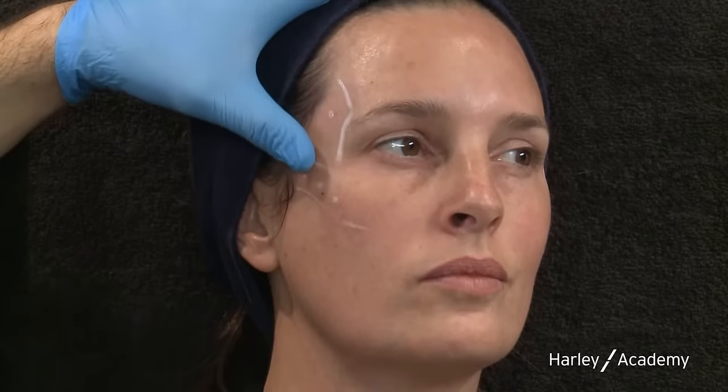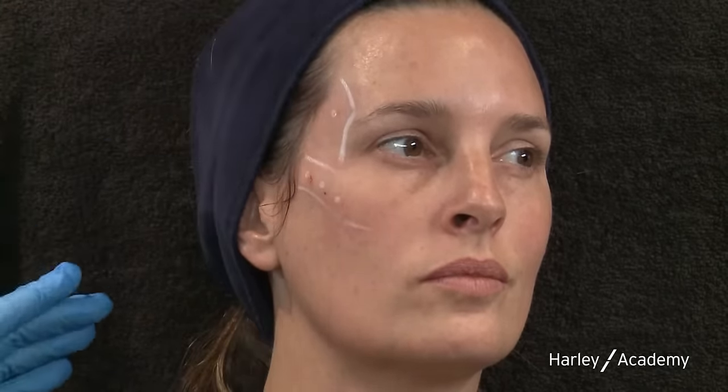I'm massaging the product down into the temporal fossa. Now let's see what difference this has made — sitting forward, looking at the right eye. We've got a fuller temple, a higher brow height, and you can see a lot more of the iris in the right eye — the eye is brighter and wider on the right side. You can also see the difference in the upper eyelid; it's much better. Now we're going to treat the mid face.